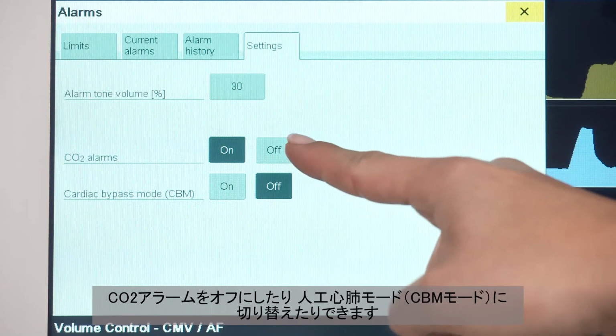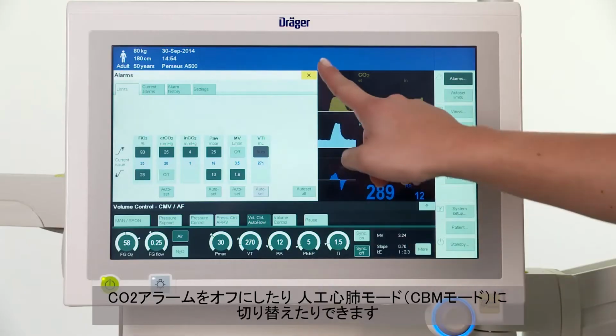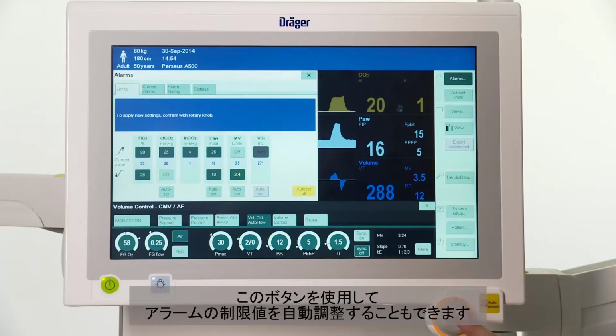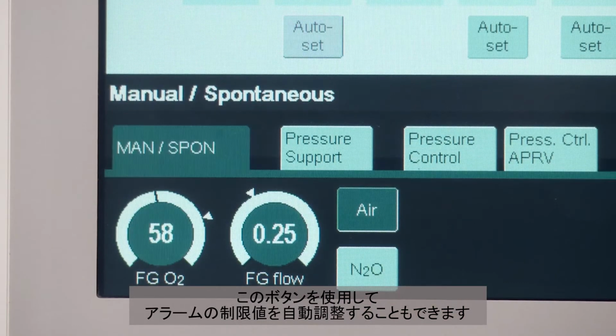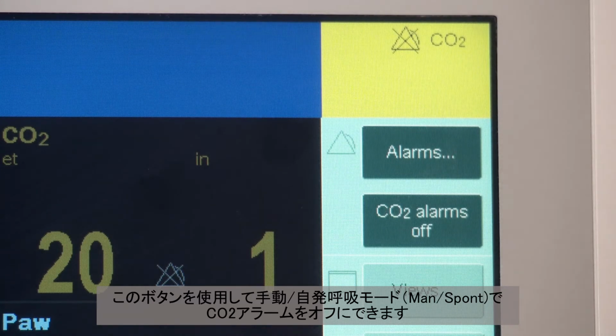To turn off the CO2 alarms or to switch to heart-lung machine mode. During mechanical ventilation, this button is used to automatically adjust the alarm limits. You can use this to turn off CO2 alarms in manual spontaneous breathing mode.